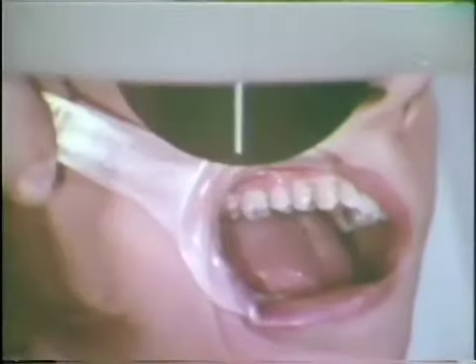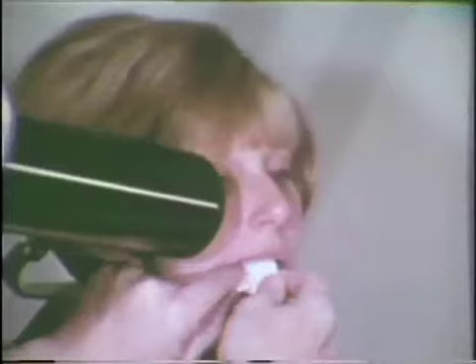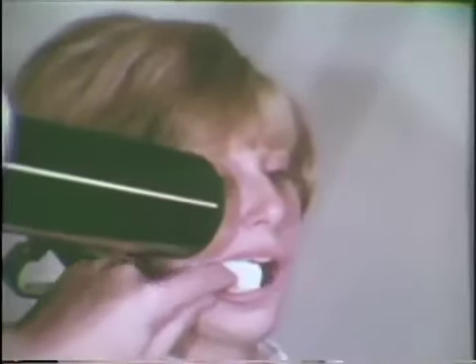Now we will demonstrate the same technique with a patient. The X-ray cone, at a vertical angulation of 8 degrees downward, is directed through the contact area parallel to the imaginary line passing through the distal cusp tips. The prepared number 2 packet is inserted and its position carefully maintained as the patient closes.